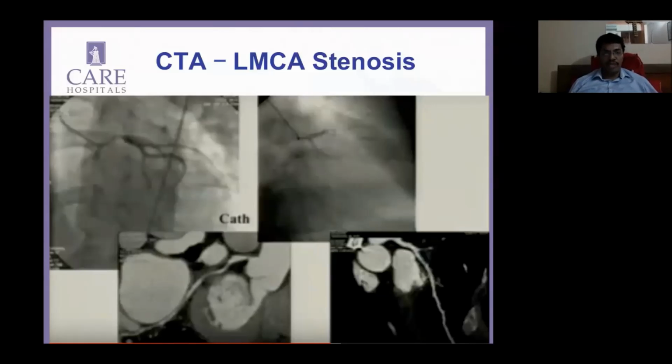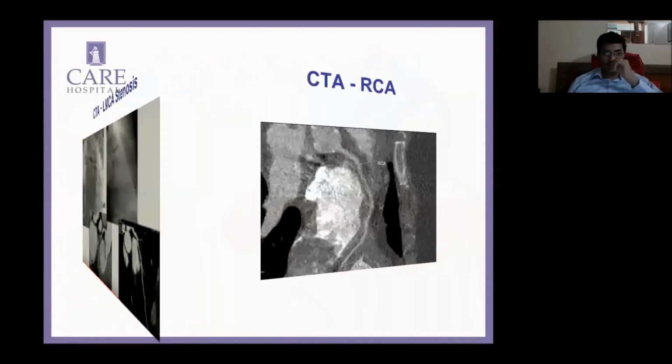Similar to what you have been saying all along. But just to tell the wider audience that CT is a great tool. You can see these two extreme cases from my lab, showing how beautifully the ostium can be looked at, section after section, in a very safe and comfortable way, rather than sweating it out in the cath lab and worrying whether the IVUS is in or out. That's just my take on it.